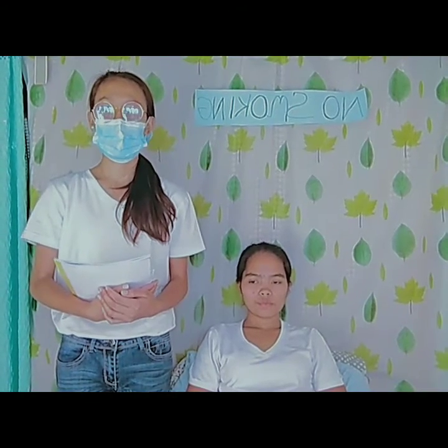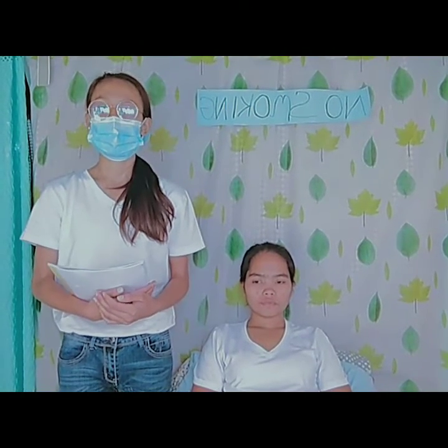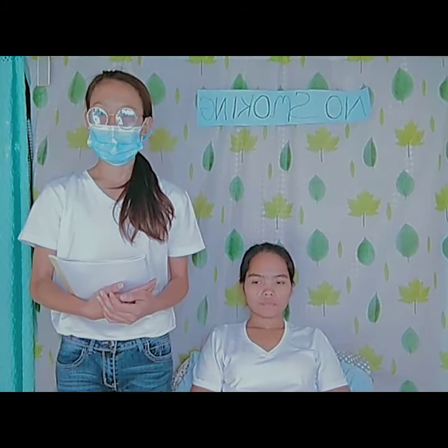Second is to perform hand hygiene. Before entering this room, I already washed my hands. The next is to identify your patient.